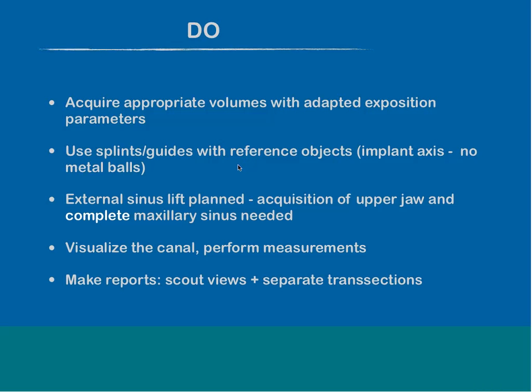Just make some scout views so that you know, okay, the data is from, let's say, the upper right jaw or lower left jaw, and in addition save some separate transections so that you can see your measurements in full screen view.